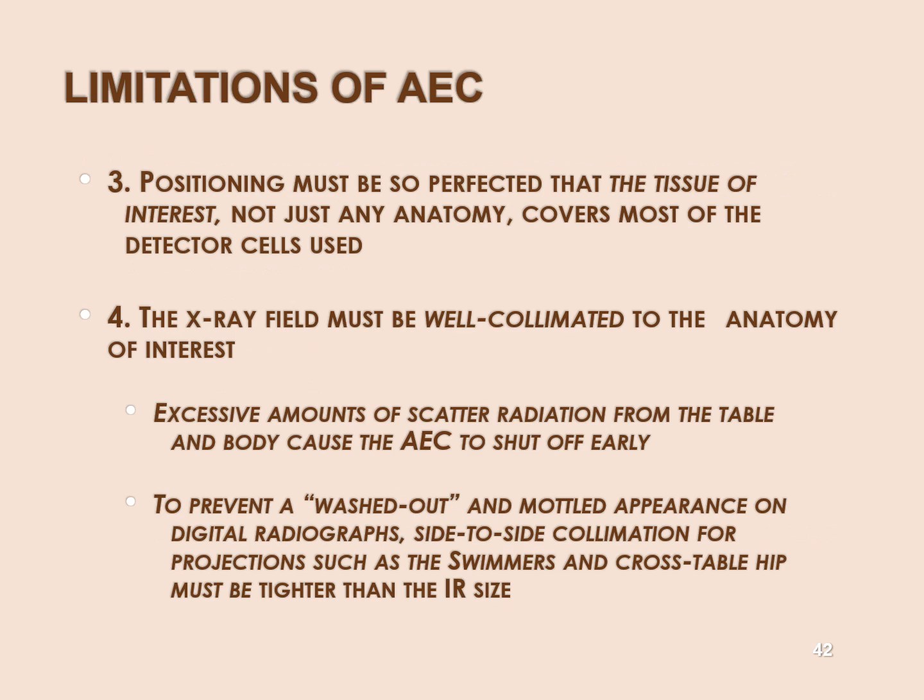Okay? So what's the key to using AEC well? Activate the correct cell, and the pertinent anatomy has to be covering and centered to that cell. If you activate more than one cell, all the activated cells have to be covered. Okay?